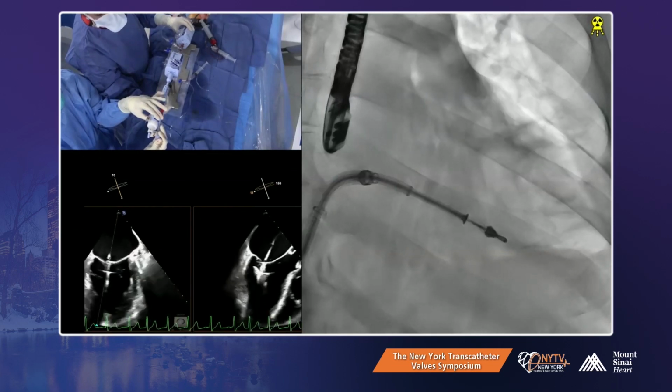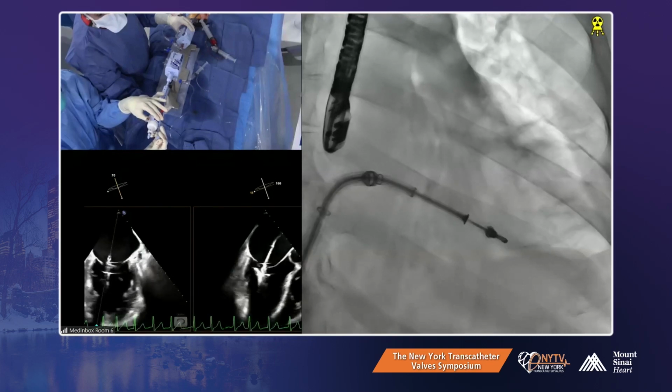No, anterior is on. It's posterior now. Okay, now you got the anterior. No, it's not on.